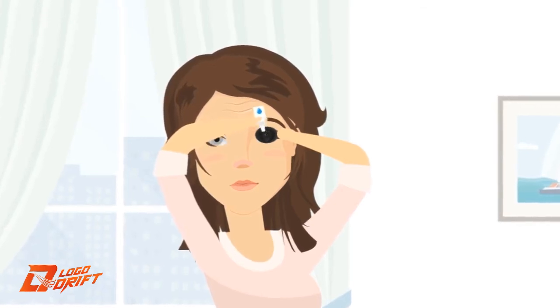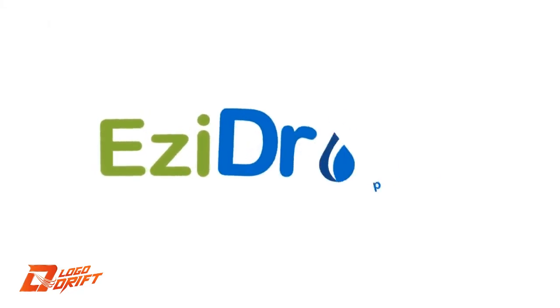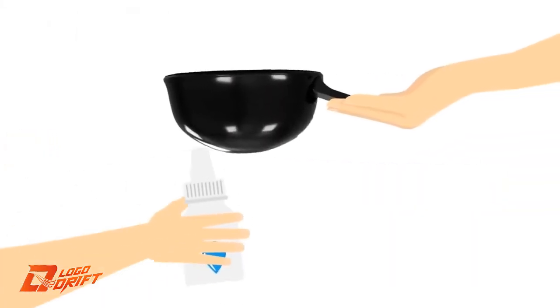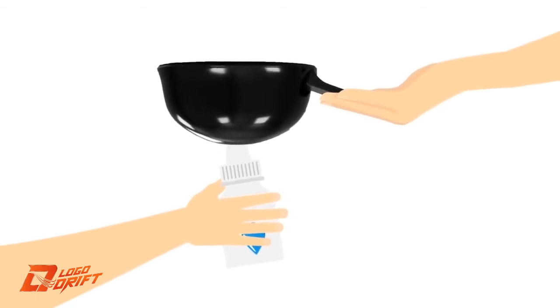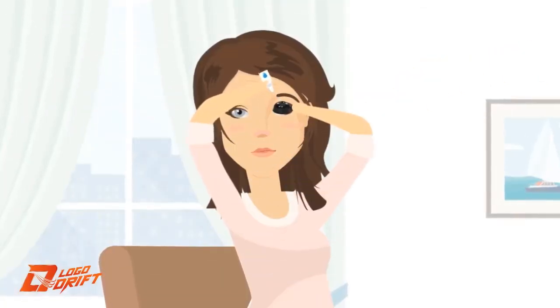The clever part is that you won't even see the drop coming. Here's how Easy Drops works: first, sit down on a chair, then hold the Easy Drops applicator by the handle and turn it upside down. Put the bottle's nozzle directly into the center of the Easy Drops applicator.